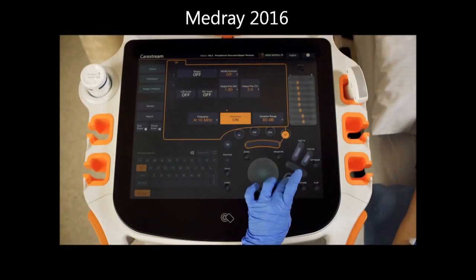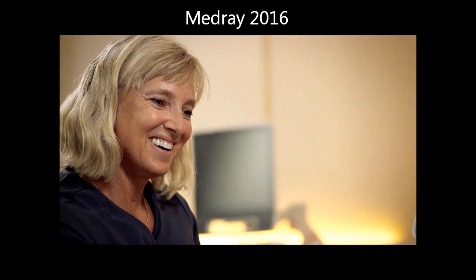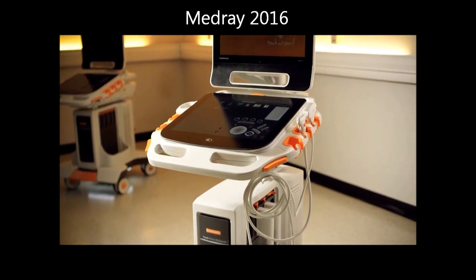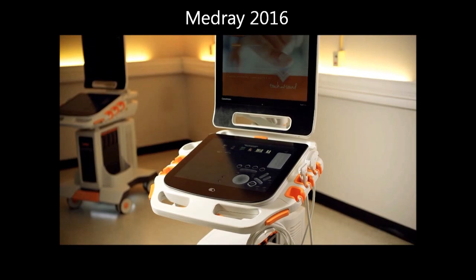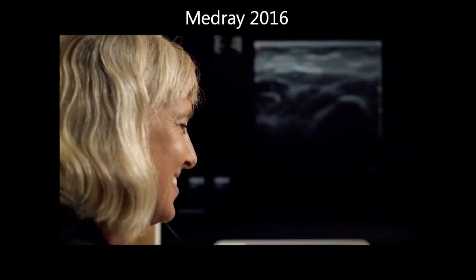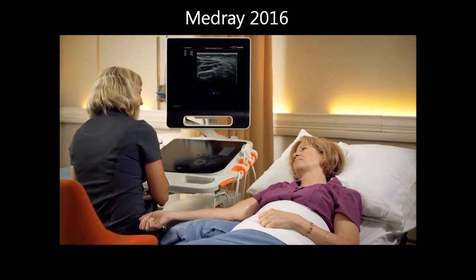You want to focus on your patient and the exam process, not on operating an overly complicated system. The CareStream TouchPrime Ultrasound System adapts to the way you work, offering extensive personalization and simplification to your workflow. Finally, you can focus on your patient instead of your equipment. It's time to make it yours.